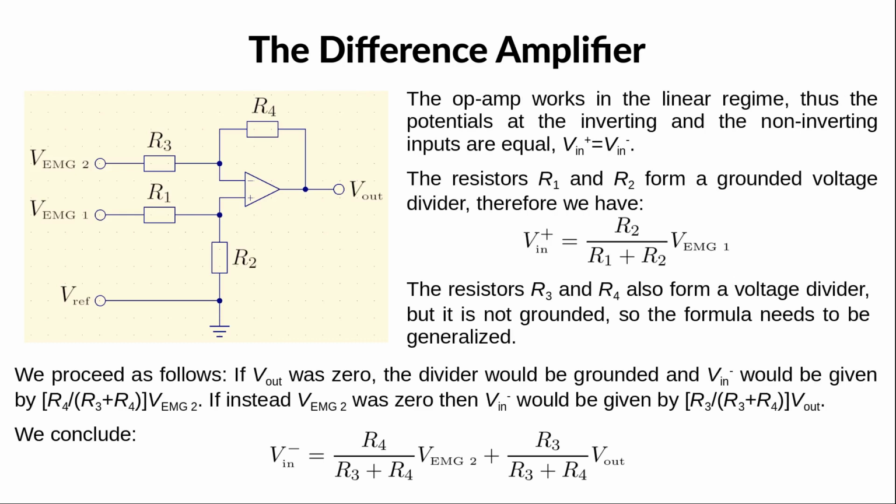The potential at the non-inverting input Vin plus is easily determined by noticing that the resistors R1 and R2 form a voltage divider that has one side grounded. Now, for the inverting input Vin minus, the resistors R3 and R4 also form a voltage divider, but it is not grounded, so the formula needs to be generalized. This is easily done by proceeding as follows.